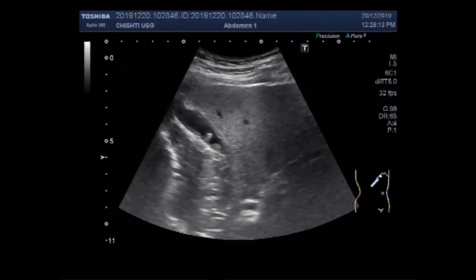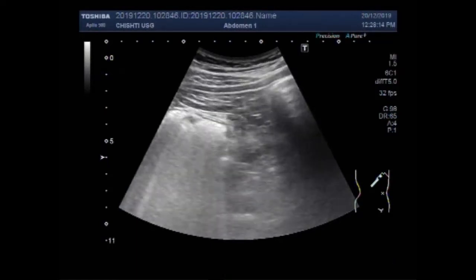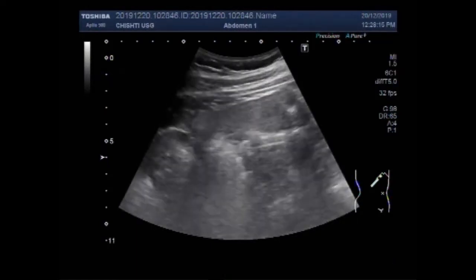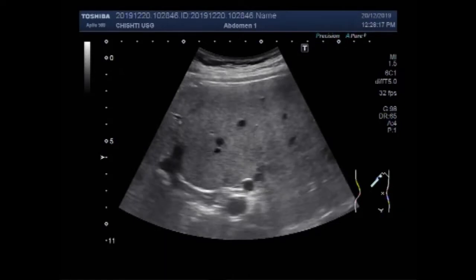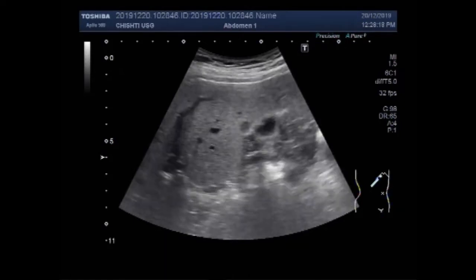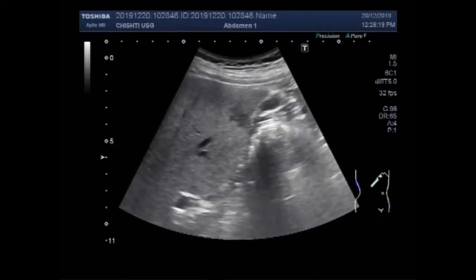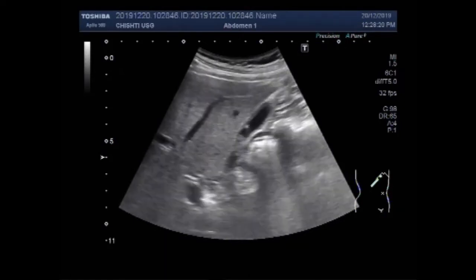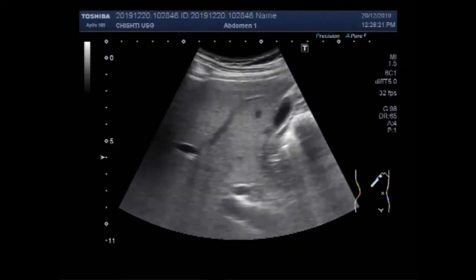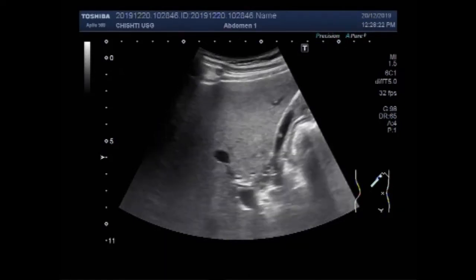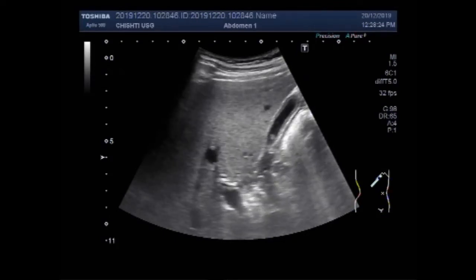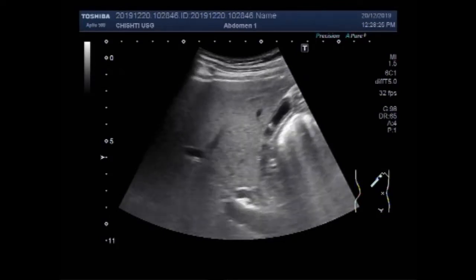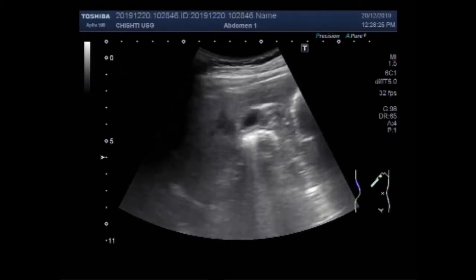Dear viewers, I hope you are all fine. These are two videos. The first video shows the gallbladder polyps and the second video shows gallbladder stones.